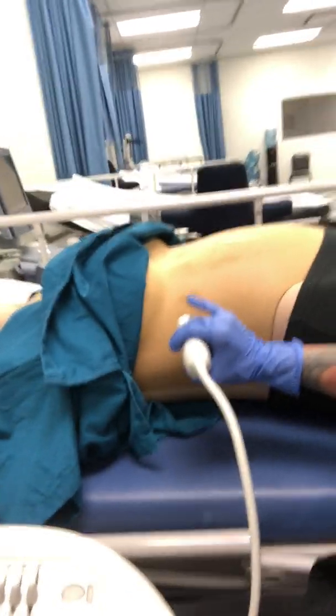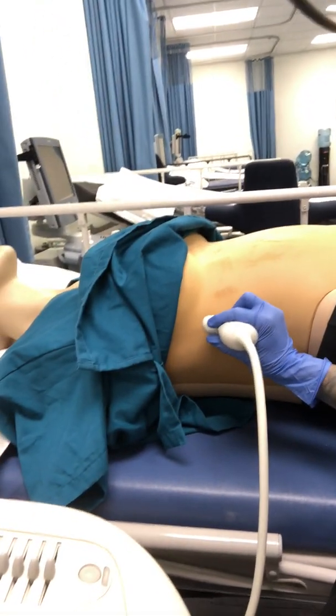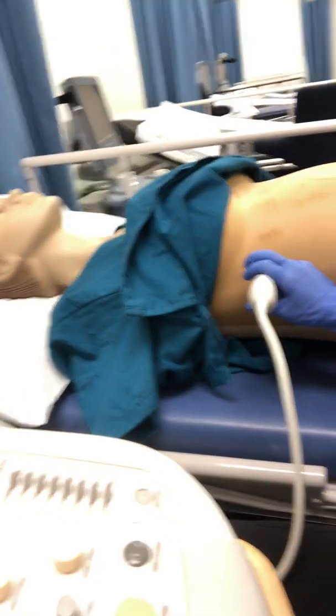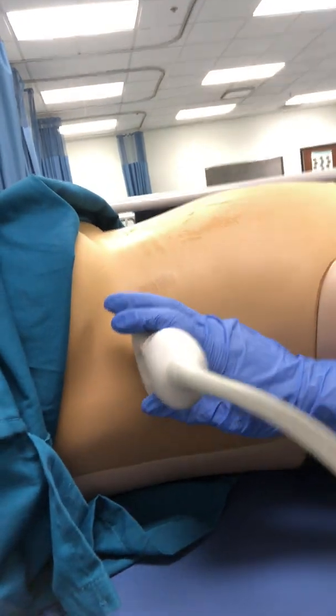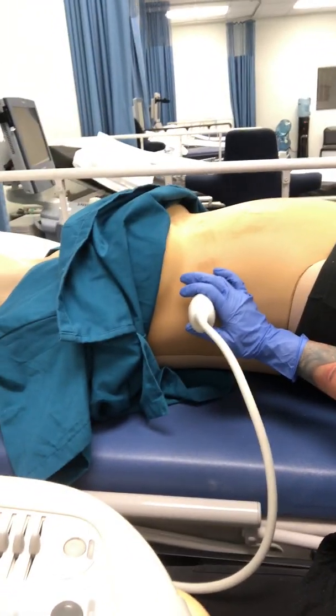However, if we go in transverse, where is our notch pointing now? Again, you can see the notch here, and I turn the probe to a transverse position. The notch is now pointing towards the table. And you can see, if we go under here, that the notch is right there. So it's pointing towards the table or the patient's posterior aspect.